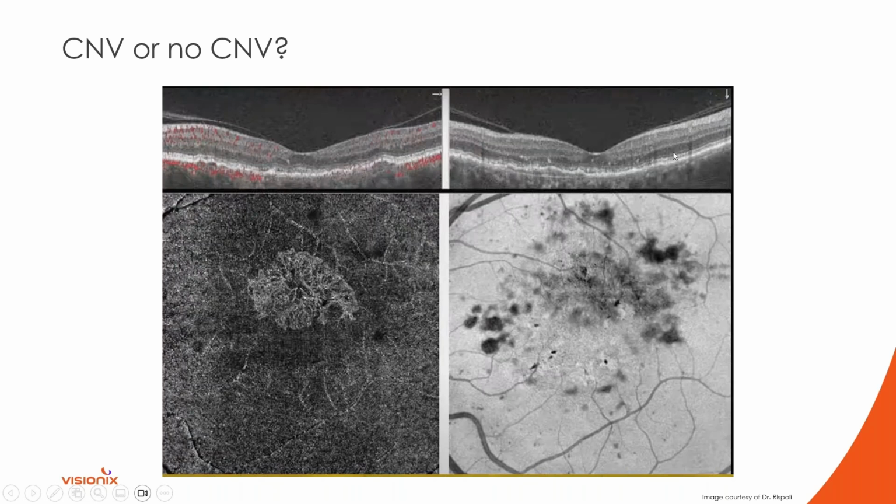If you're watching this and you say, well, I wouldn't have identified that, if you had OCT-A and you were running them simultaneously, then guess what? You wouldn't have missed it, right? So these are very, very important examples of things that we don't want to miss. Even if we think we're super good at looking at OCT, these are examples of patients where, unless you're stellar, and none of us are perfect, this might be missed.